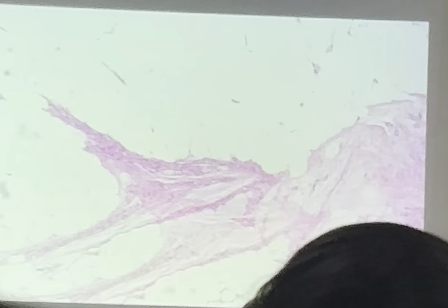So, if I told you that this is a mass on maybe the upper back or shoulder, what would your diagnosis be? Lipoma. Lipoma. Okay. Is this benign or malignant? Benign. It's benign. Now, let me ask you, is this a well-differentiated, poorly differentiated, moderately differentiated, or just completely anaplastic? It's well differentiated. What do you mean when we say something is well differentiated? It looks exactly like normal tissue. In fact, you wouldn't even say this is a tumor if I told you. If I told you this is just a subcutaneous tissue, you would probably believe me, right? Because it looks identical. It's well differentiated.